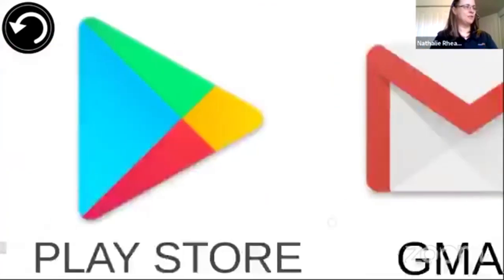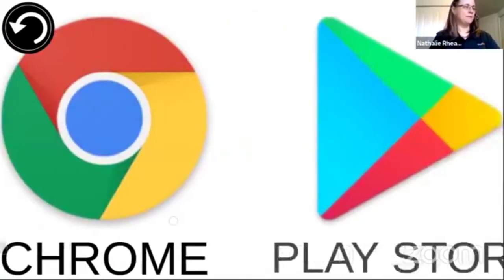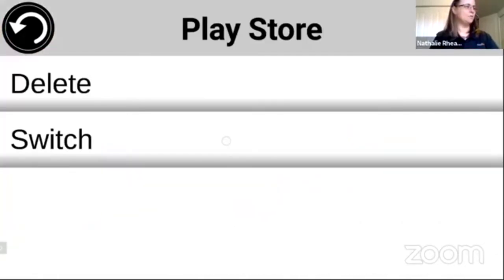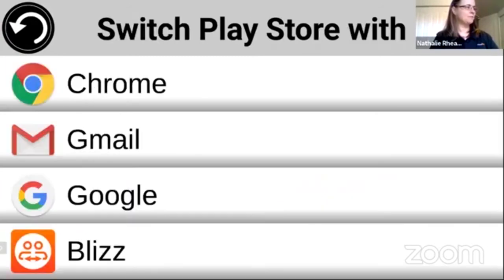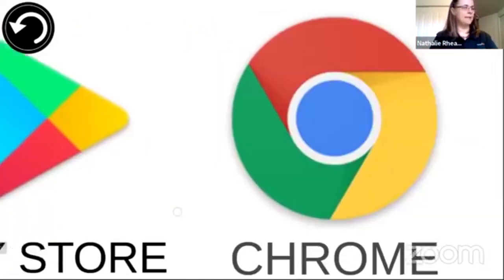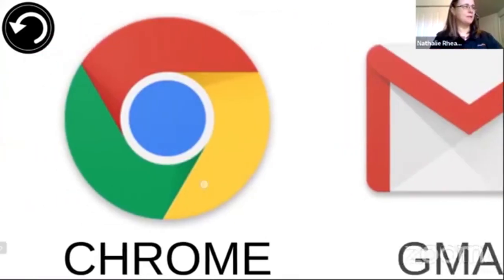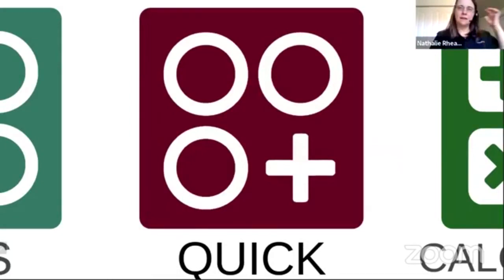If I want to change the order, if I want to have the Play Store in front of Chrome, I tap on Play Store, press and hold, switch with Chrome, and then I have the Play Store at the beginning and Chrome afterwards. So that's a place where we can have a hyperlink of quick access to apps that we want to have frequently.